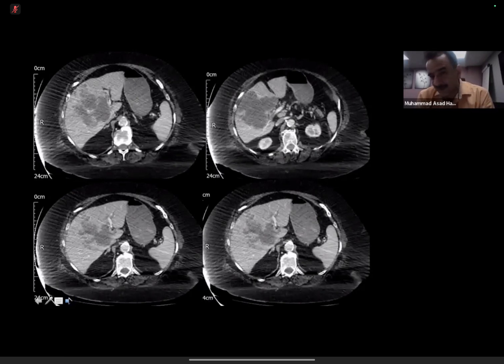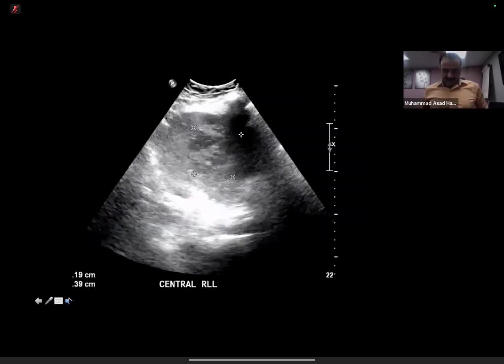So basically this patient, you have very rightly pointed out the three differentials, but when it was presented to us, it was discussed in the MDT, and the concern was that as the patient is unwell, it could be a liver abscess, because previously the patient did not have anything. So the patient went on to have an ultrasound to drain the liver abscesses, but actually nothing was found.